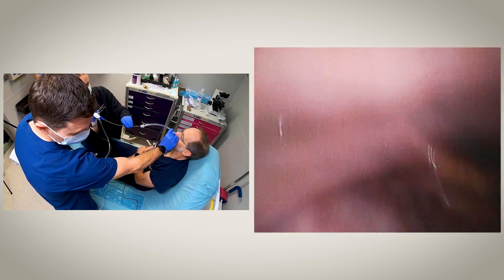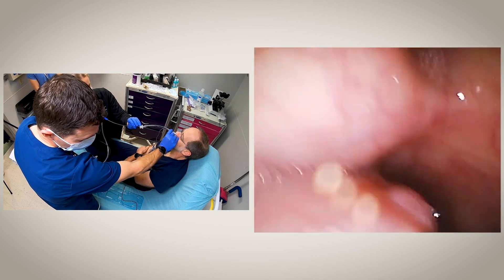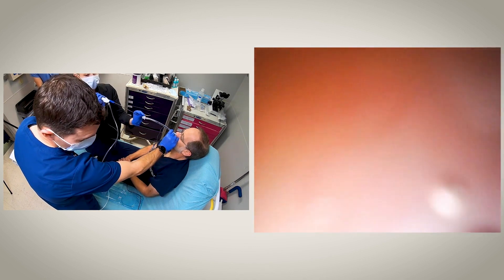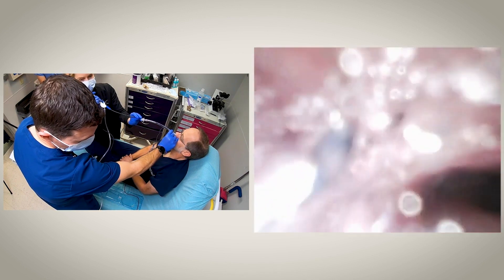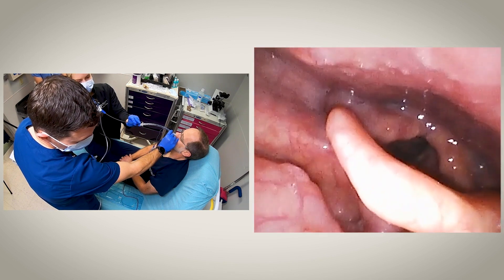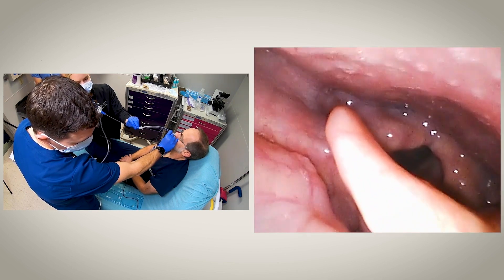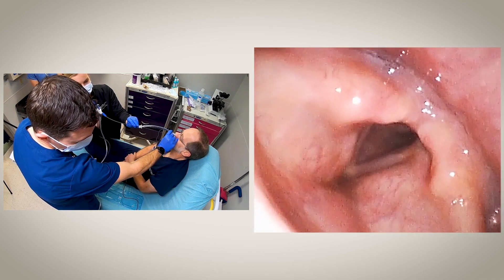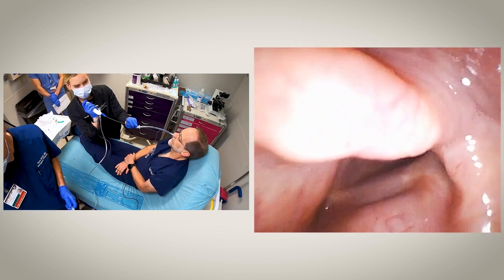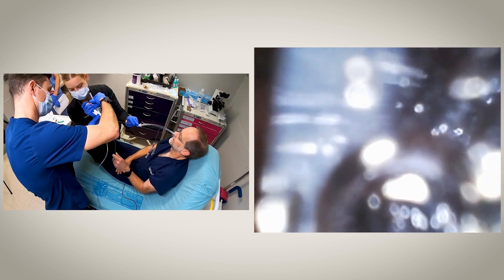Next, we're going to advance past the epiglottis and do our second injection of 4% lidocaine through the bronchoscope onto the cords themselves. Just try and keep your target in the center of your screen. It's a slow, methodical advancement of the scope down past the epiglottis — which is now well anesthetized — down to the level of the cords. At this point, we are going to give our second dose of 4% lidocaine: 1 mL in a 5 cc syringe filled with air.